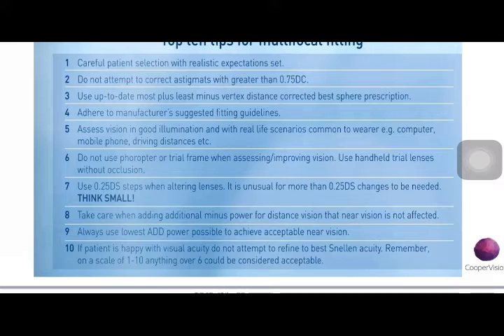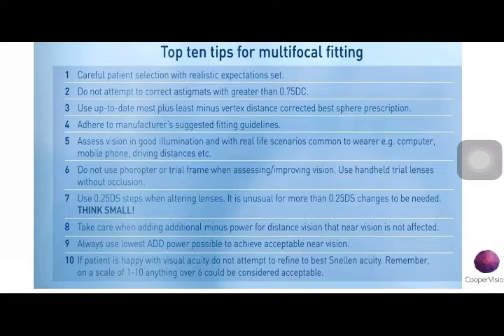Now, after this, do remember that with age, your patient's pupil is becoming smaller. It will not become large, right? As your patient grows old, the pupil will become small. And this is the time when you should always remember that if the pupil is round, reacting and regular, the dominant eye should get a low add in case of a center near design. Because if you give a high add, the pupil might become small and your addition zone will increase. So the patient will find it difficult to suppress the bigger zone, and they will always complain of ghosting of images, halos and glares.